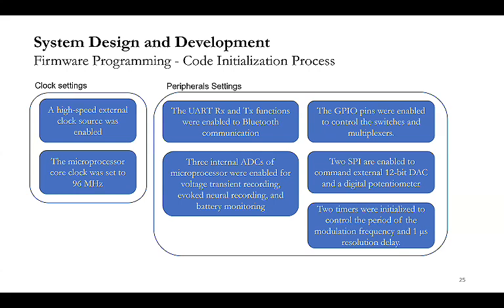And we also have SPI communication, serial peripheral interface communication, to control the external 12-bit DAC. And because we had to get microsecond delay resolution for the pulse width, I use certain timers to generate these signals.